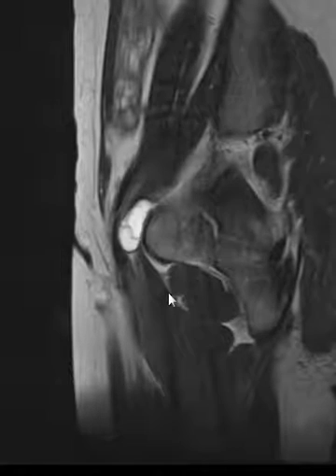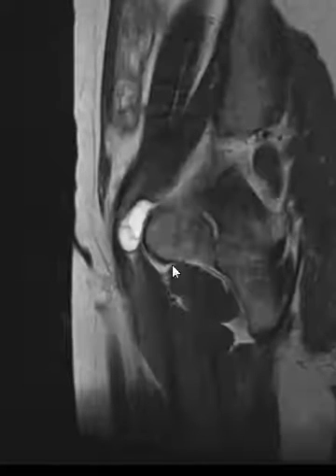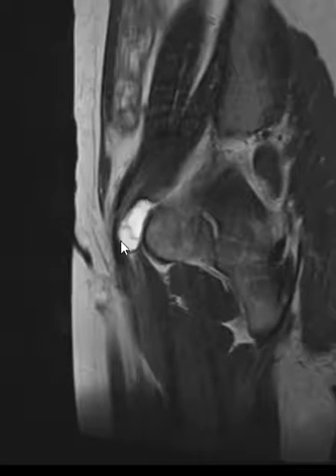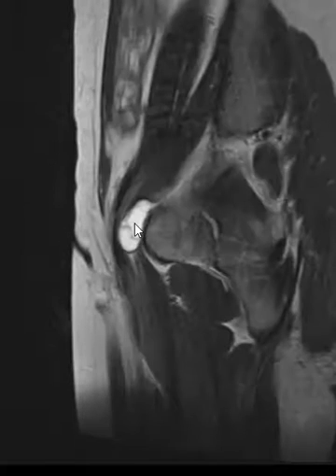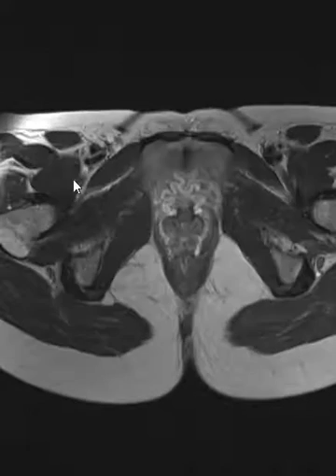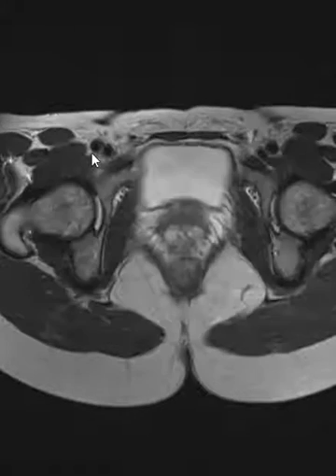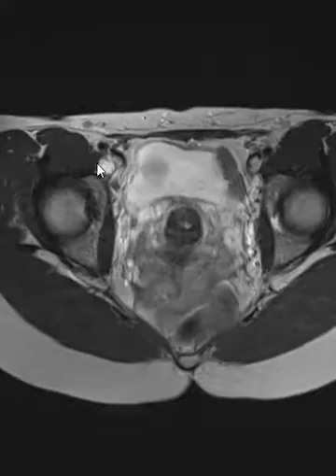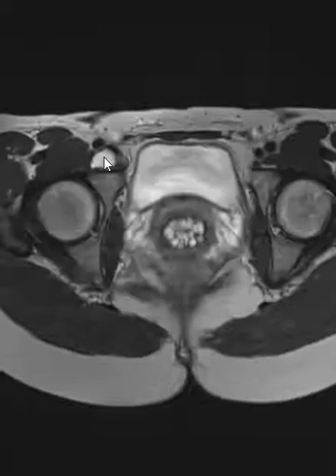And here on the sagittal T2 sequence, we see it along the anterior margin of the acetabulum. You can see its teardrop shape, with multiple internal septations. Following down here, we can see the iliopsoas muscle — the bursa is over in this region — so it may contact the medial margin of that bursa.